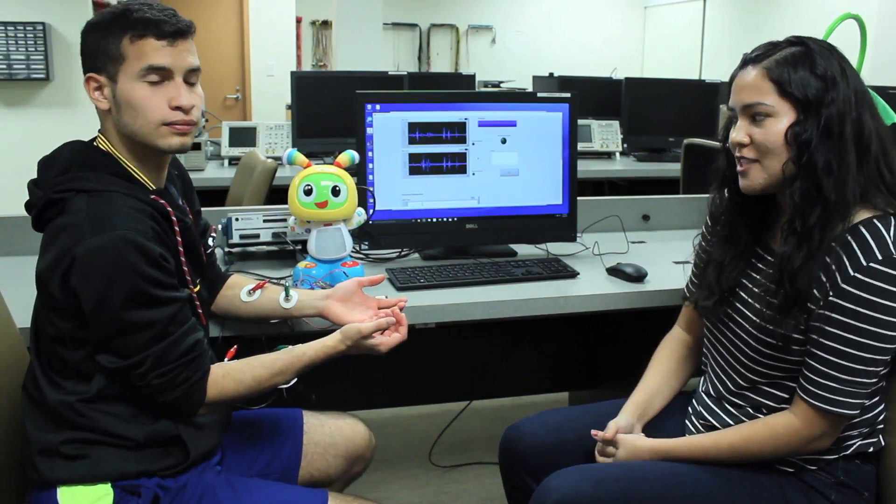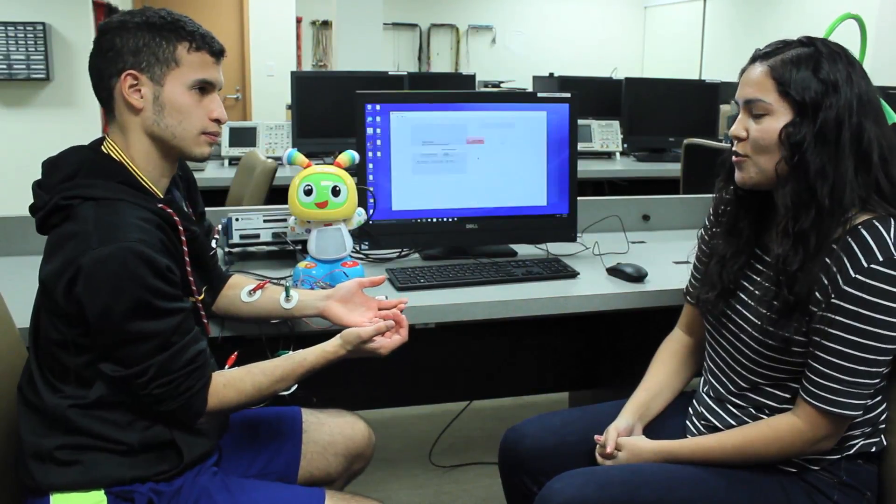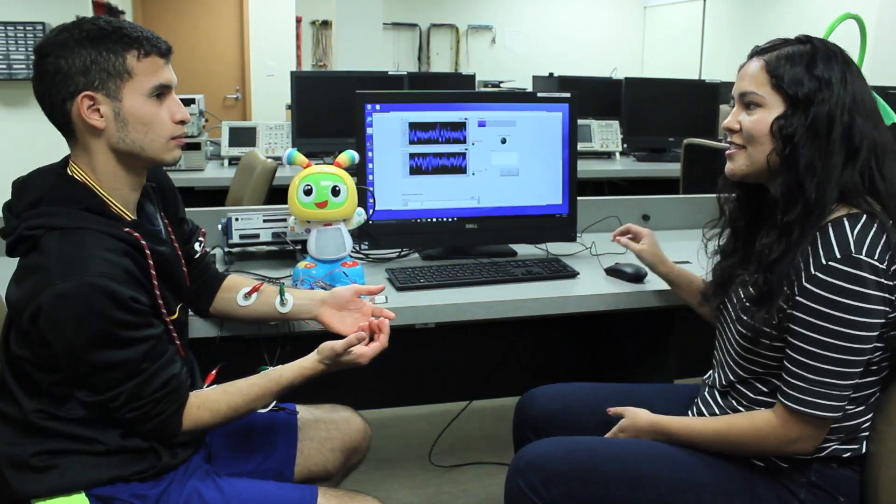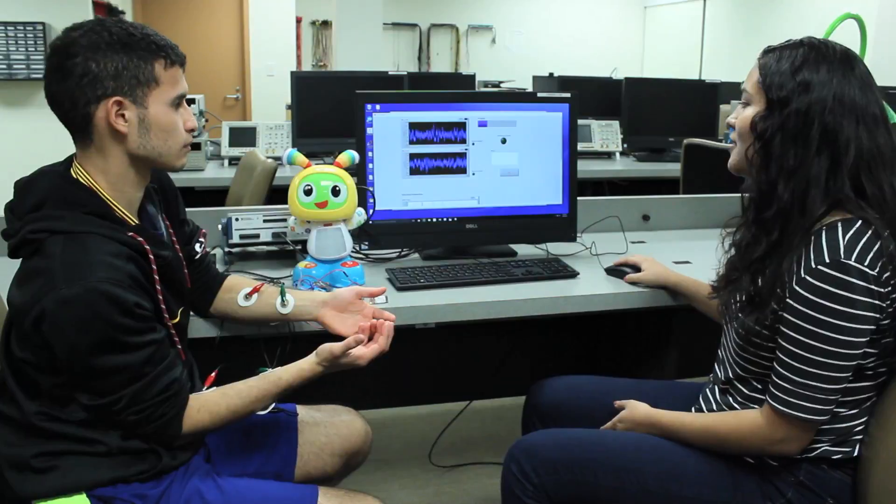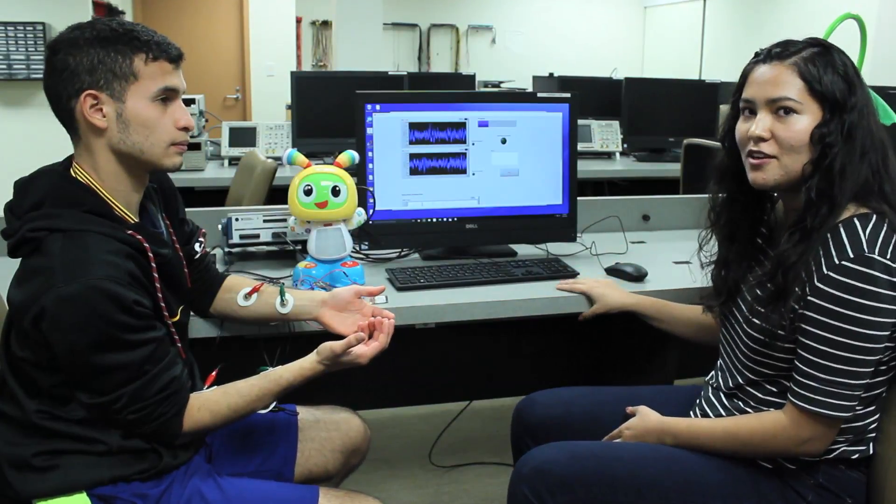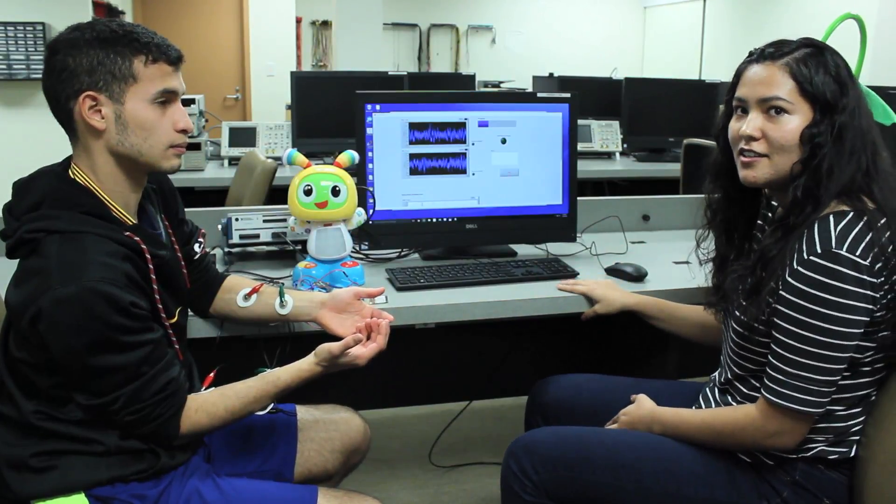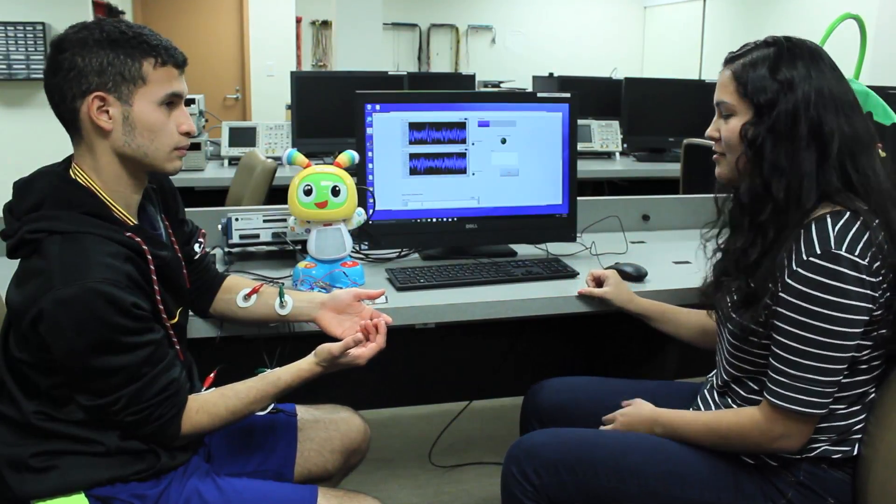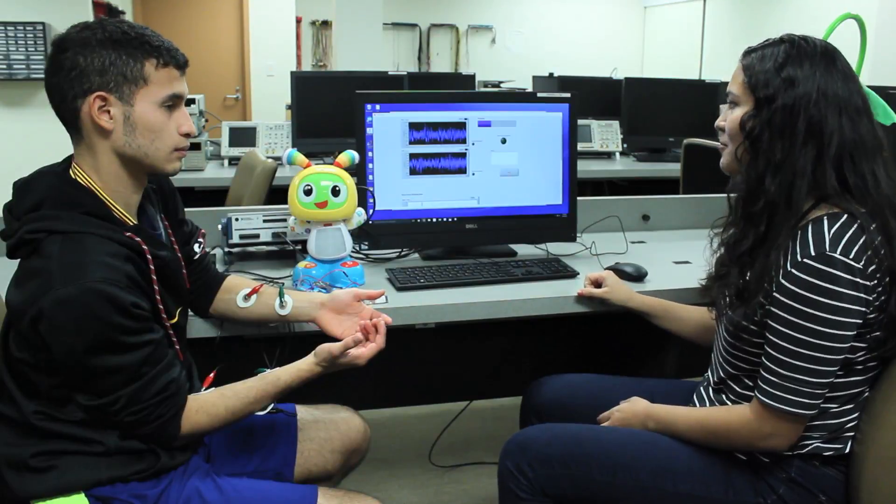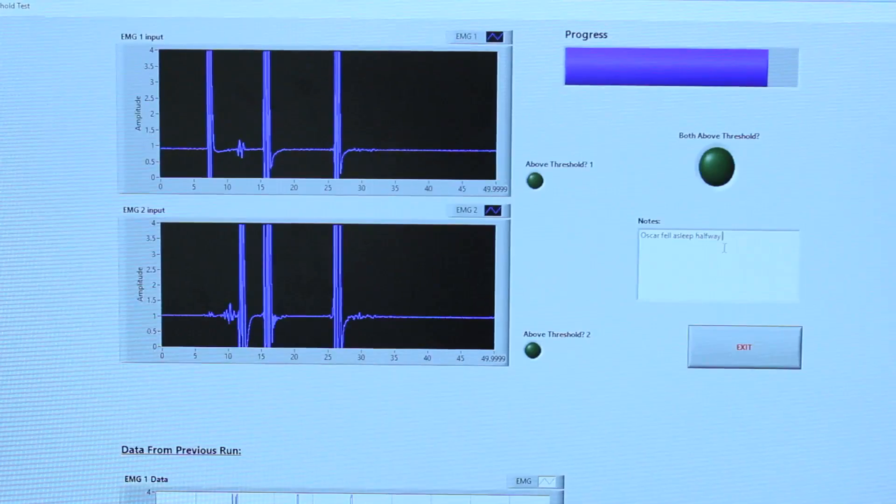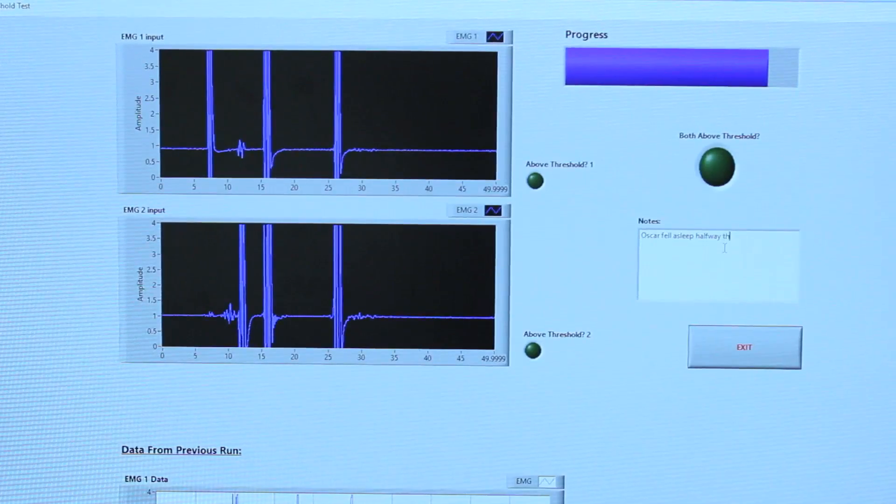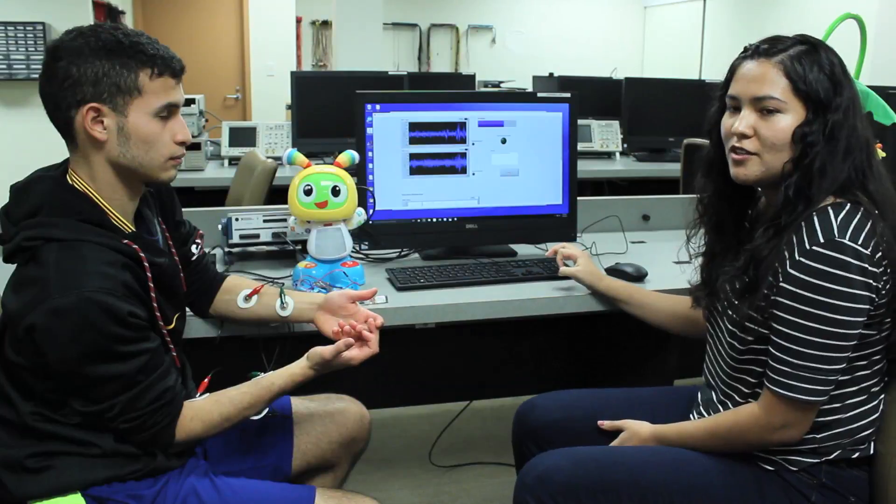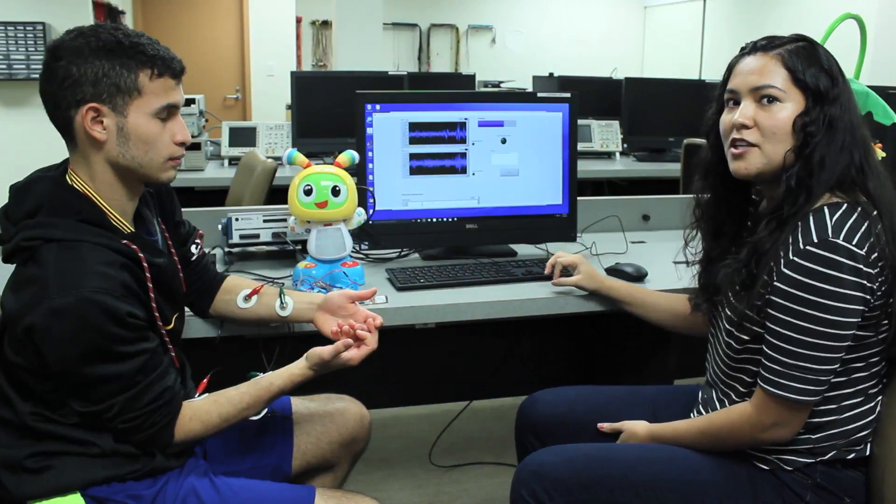When both muscles are activated simultaneously, the toy will play and the music will play as well. If something were to go wrong during the session, you can include it in notes. There's a box here that you can type whatever is wrong. So, for example, if Oscar fell asleep, all the notes that you make will be included in your patient data file.